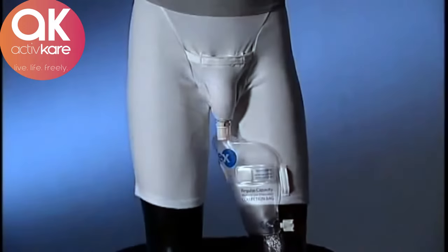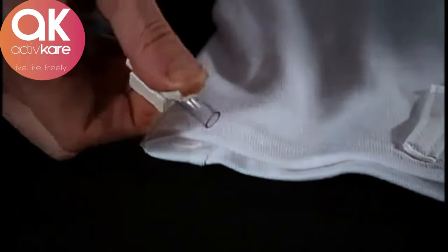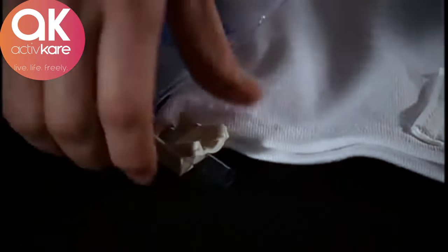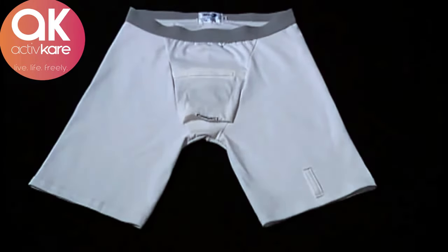Firmly push together and turn to the blue notch to lock the bag to the receptacle. Once assembled, urine is collected directly into the bag and can be drained at your convenience and discretion using the easy open drain clamp. Our briefs also offer a unique horizontal fly, which gives you the option to urinate normally.